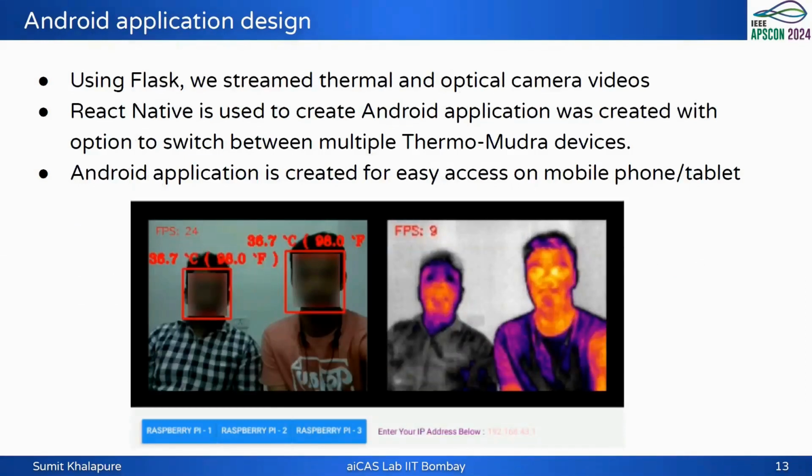In the IR image, we are looking at the IR pixels. Those are the radiations coming from the face, and they are very easily distinguishable from the environment. You can see the yellow patches around the face, and those patches are averaged out based on the optical image I am taking. We need to make sure that the background is plain, because background environment noise also affects the average value of the temperature that we are taking on the face.